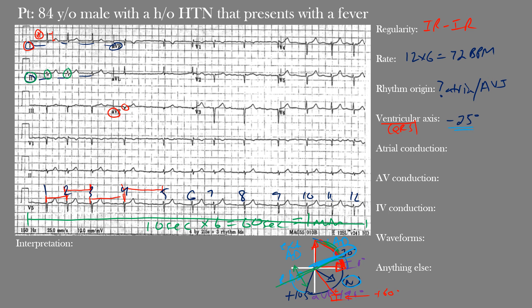So the approach is: look at lead I, lead AVF, then add lead II to determine whether we're in a pathological leftward axis shift or still in the normal range. You could note the axis was near negative 30 degrees by recognizing that lead II is nearly isoelectric, meaning the ventricular or QRS axis lies perpendicular to lead II, placing it near negative 30 degrees.